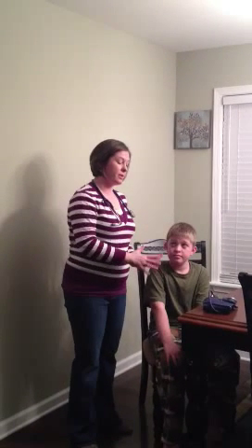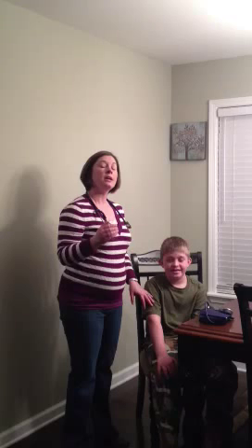And for an adult, a child I'll pump up to about 140, and an adult, depending on if their blood pressure runs high, I may pump it up to 200 or 220. And then let it out slowly, and then I'm listening for a heartbeat, and when you get down to the first heartbeat you hear, that's systolic, that's your top number. And then you listen to the heartbeat as you let out the air in the cuff, and then the last beat you hear is a diastolic number, which is the bottom number.